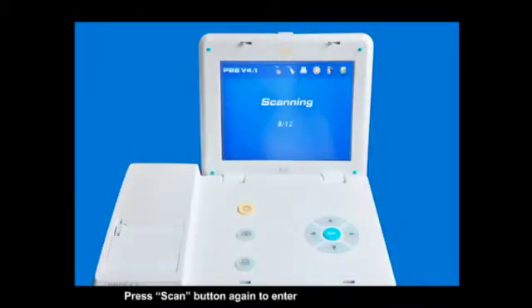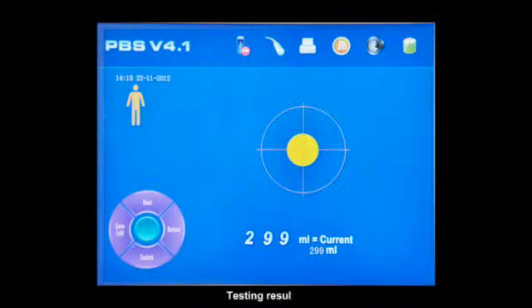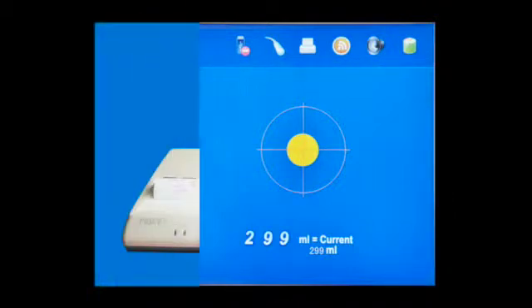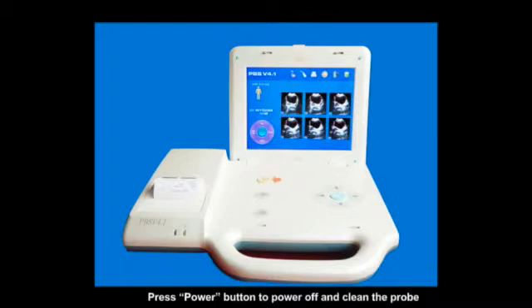Press the scan button again to enter the scan interface. Test result. Press the print button and print out the result. Press the power button to power off and clean the probe.